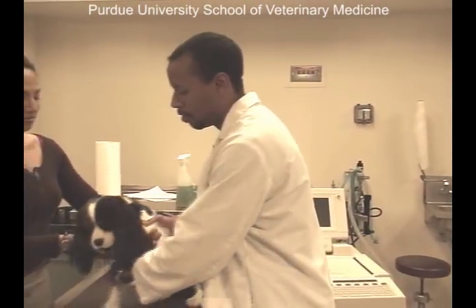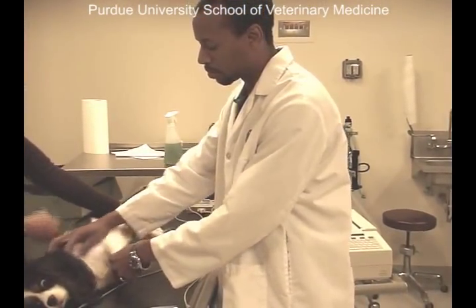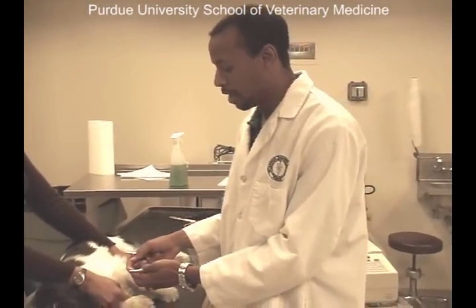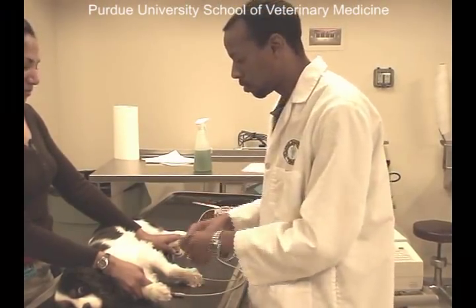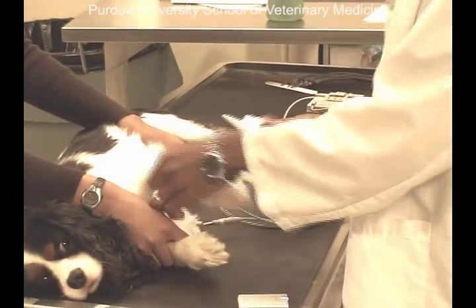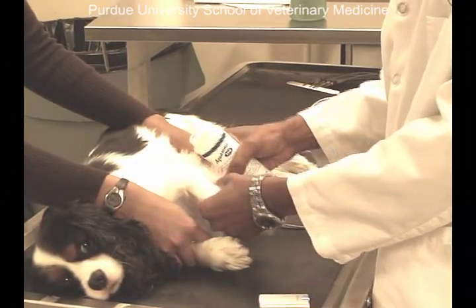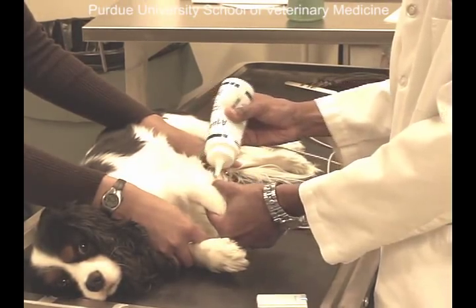To do this, we will place him down on his right side and lay him down, and we place little leads on his legs using alligator clips. If we were to do this on a human, they would use little sticky pads to place on the skin. In dogs, because we have so much fur or hair, we have to use these clips to stay on the animal pretty tightly. Now because dogs and cats have so much fur or hair, we have to use alcohol or gel to get the attachment of the leads closer to the skin. So we apply gel to the electrode right at the skin and rub that in.